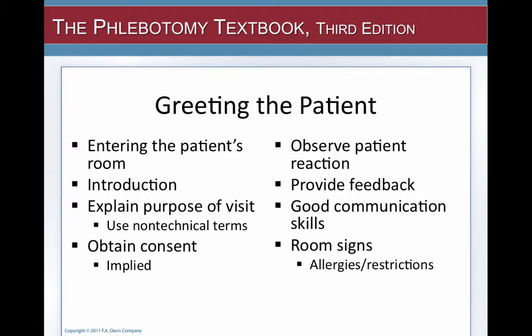Sometimes you'll walk into a patient's room and they will not be conscious. If they're sleeping, gently wake them up. But if they're in an ICU, they may be sedated, and then consent is implied. The physician did want these tests ordered. Always observe the patient's reaction. Are they nervous? If they're nervous, try to put them at ease and provide feedback to them. Say, could you please extend your arm, and let them know that's a good position or not. So you really want to have good communication skills.